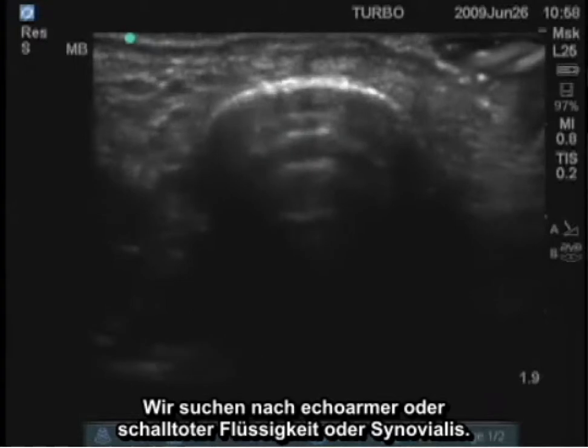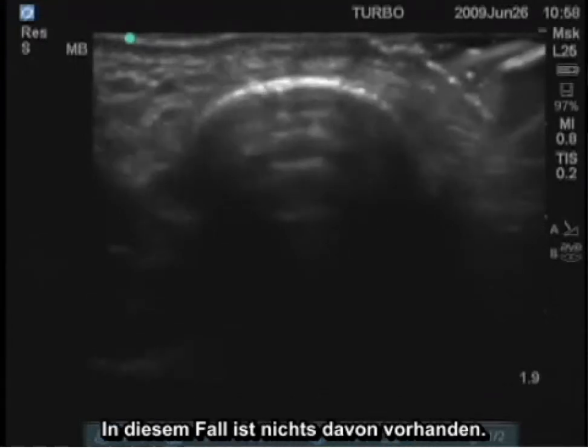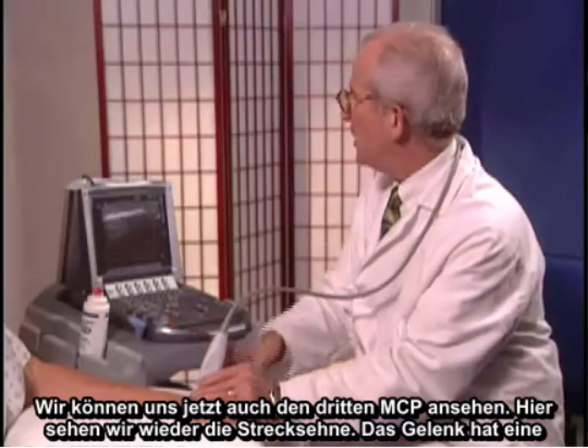We'll then take a transverse image and see a transverse oval image of that extensor tendon. We're going to look for hypoechoic or anechoic fluid or synovium around it. In this case, none of that is present.